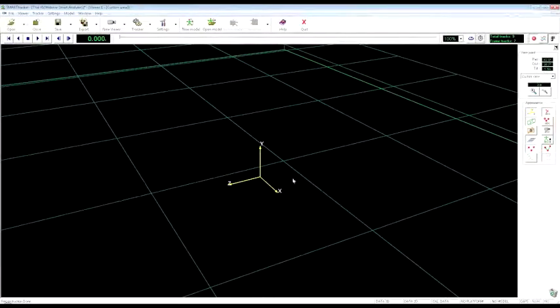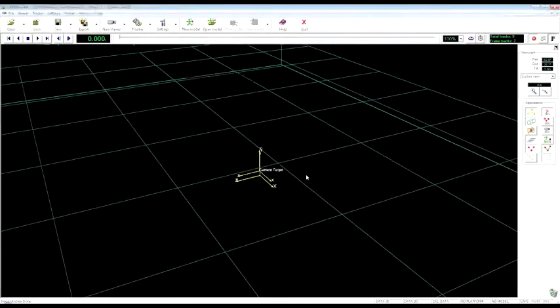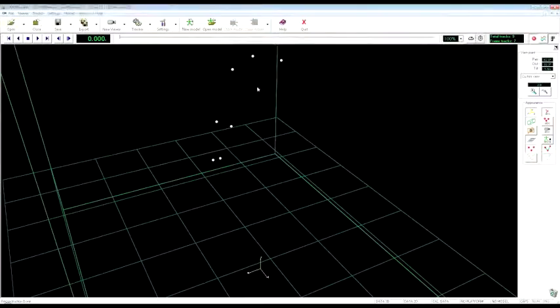Its position is defined during the calibration procedure. So the 3D components of each marker are defined frame by frame with respect to that position. If we click on play, we have the chance to see those markers moving while the subject is performing the movement over the complete acquisition. Otherwise, if you prefer, you can also play the movement frame by frame, going forward or backward.